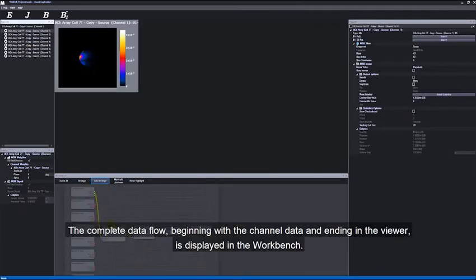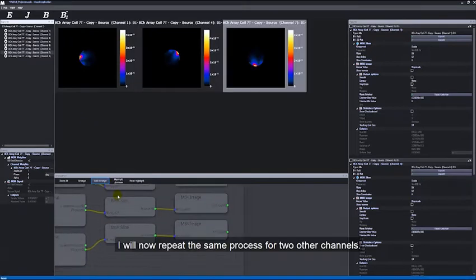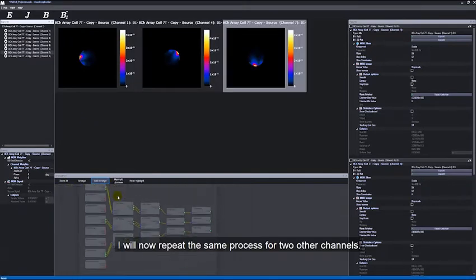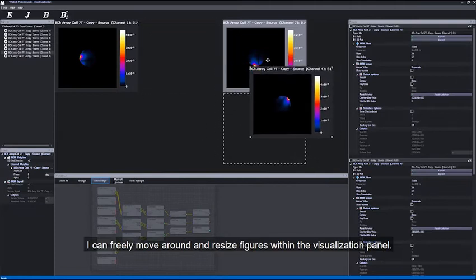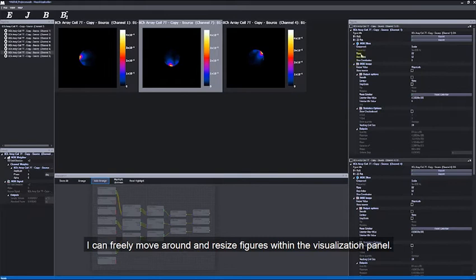The complete data flow, beginning with the channel data and ending in the viewer, is displayed in the workbench. The workbench becomes really handy as soon as more complicated analysis pipelines are set up. I will now repeat the same process for two other channels. I can freely move around and resize figures within the visualization panel.